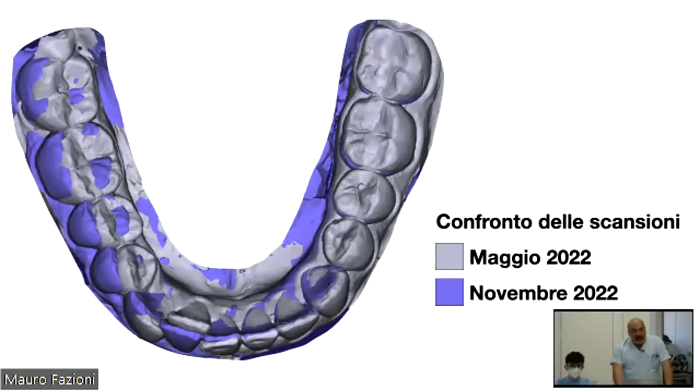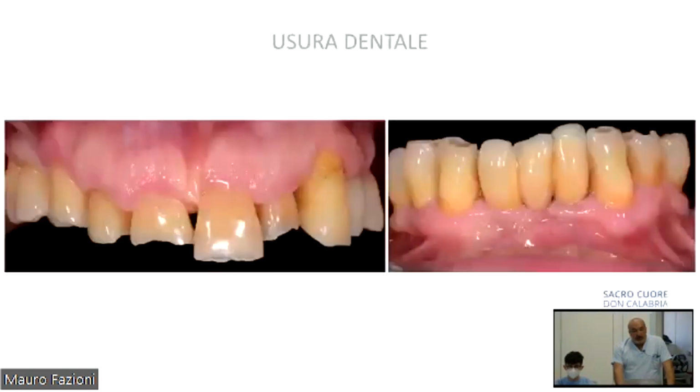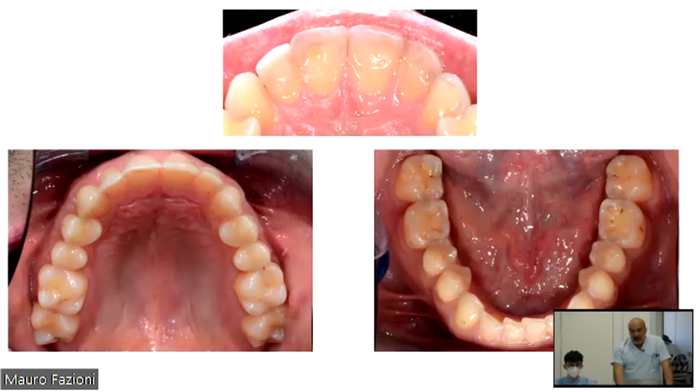Here you can see cases where a little movement of the teeth is very useful to give an aesthetic solution to our patients. Worn dentition will be the pathology of our future. It's very important for us to understand this and to improve methods where the solutions are less invasive.